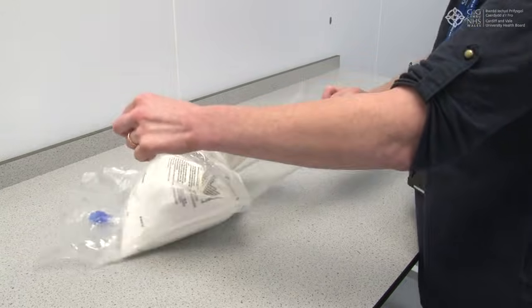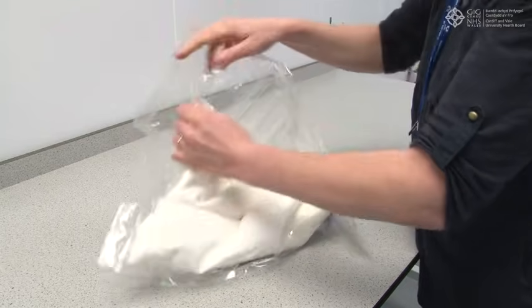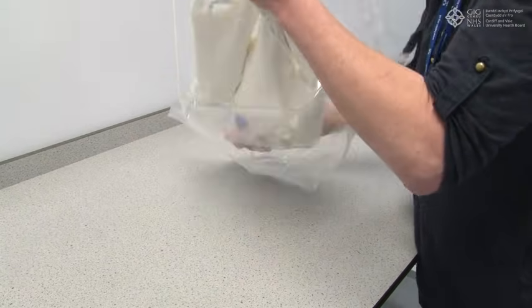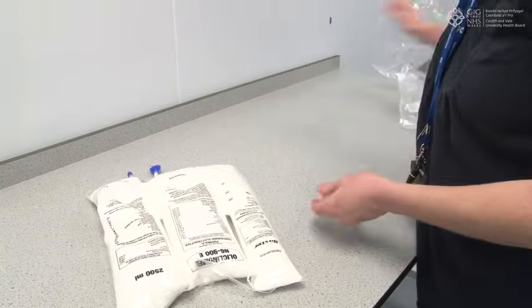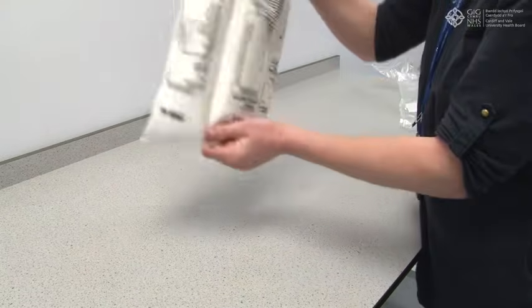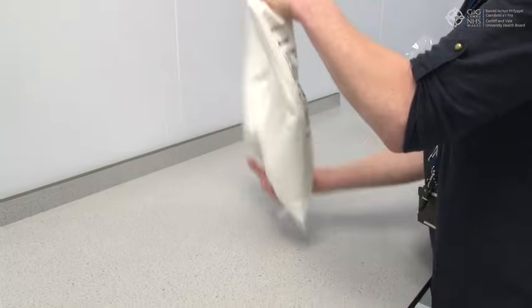Peel the front of the over-pouch to reveal the bag. Discard the over-pouch and oxygen absorber sachet. Mix the bag by turning it upside down at least three times.